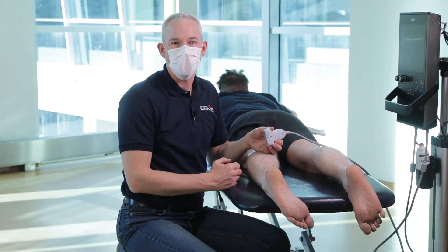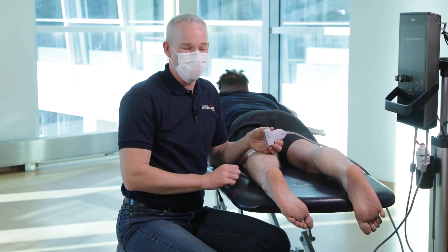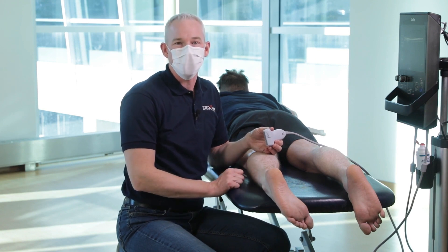Hi, Dr. Frank Johnson from Sport Medicine Ultrasound Canada. I'm going to show you how to scan and inject the tibial nerve near the tarsal tunnel.